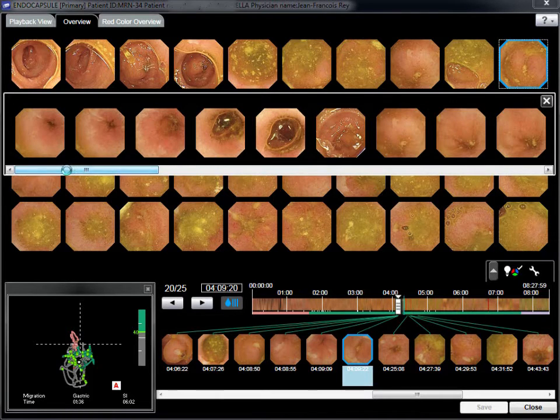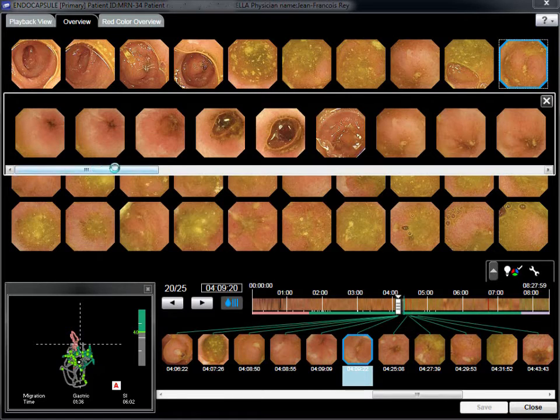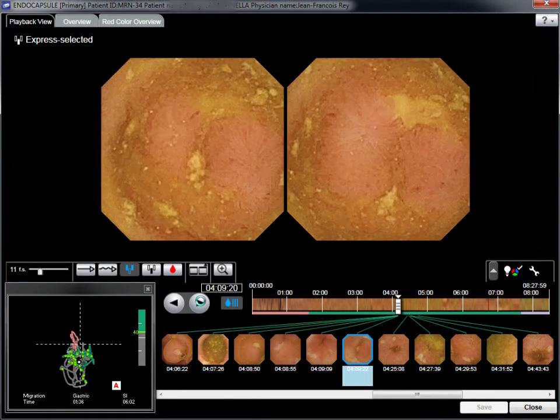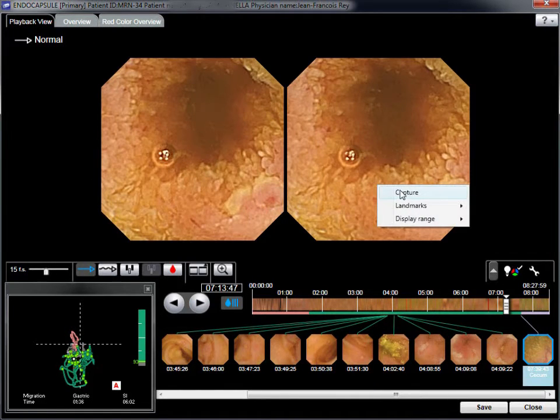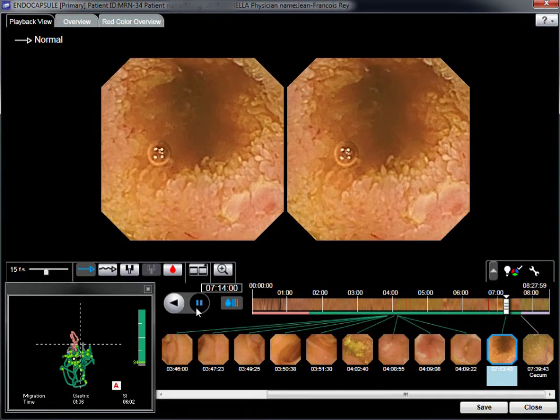Inflammation is present in the last part of the ileum, where a very tight stenosis with ulcerations and inflammation can be seen. Despite the stenosis, the capsule was able to move on to the colon cecum.